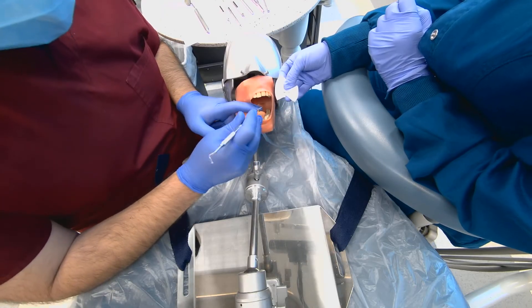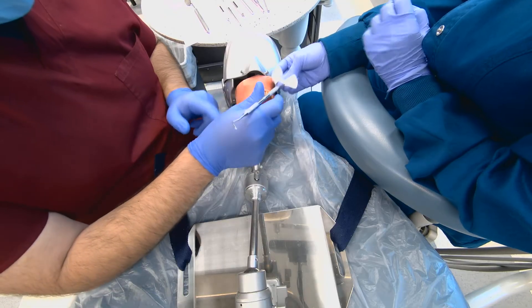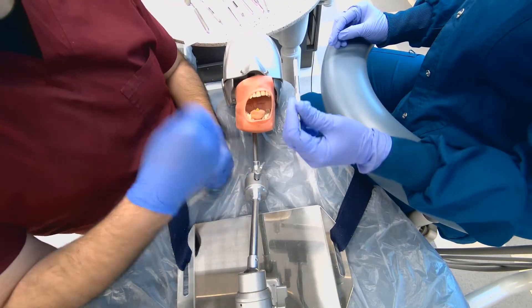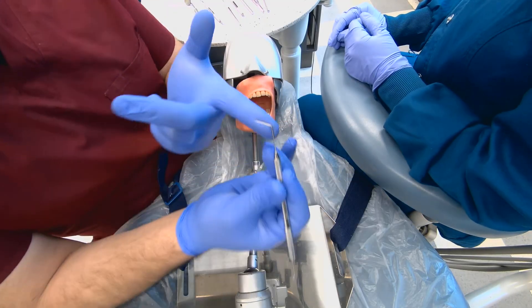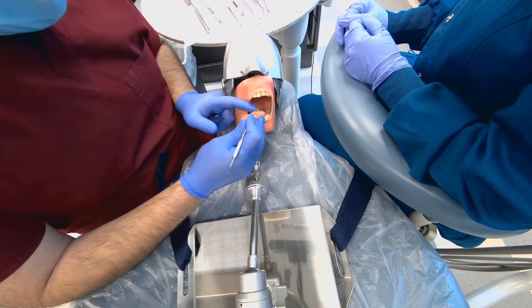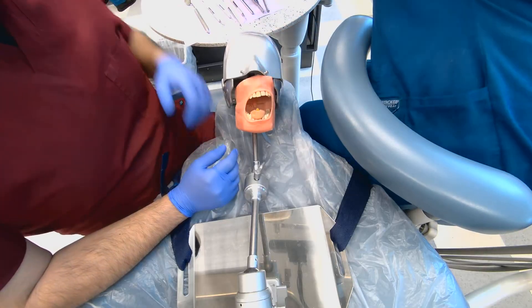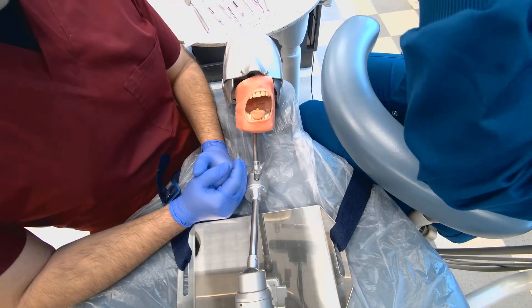Some of these steps can be skipped depending on the system the dentist is using, but we're trying to show all of the instruments and how they're used. Once we remove the major parts of the pulp chamber, we can use the endo explorer to locate the canals and see how many canals there are. In this tooth we have only one canal, and now we use the barbed broach to remove the nerve from inside of the canal.